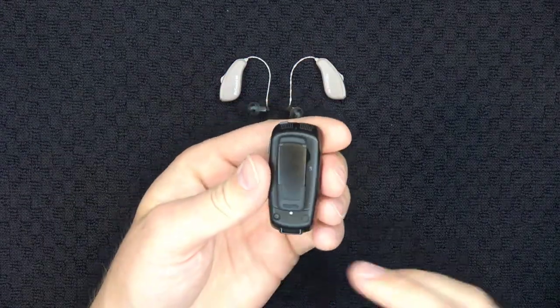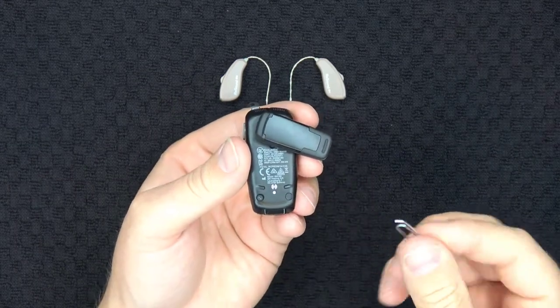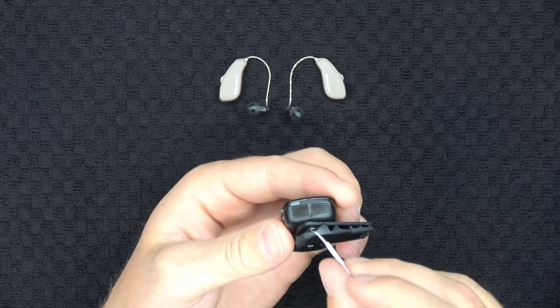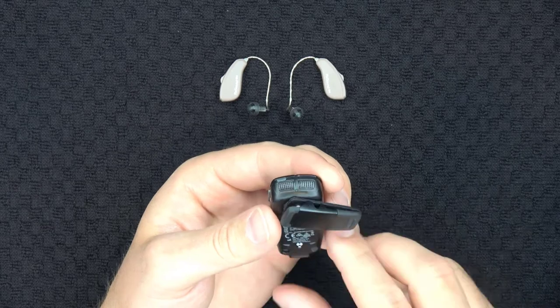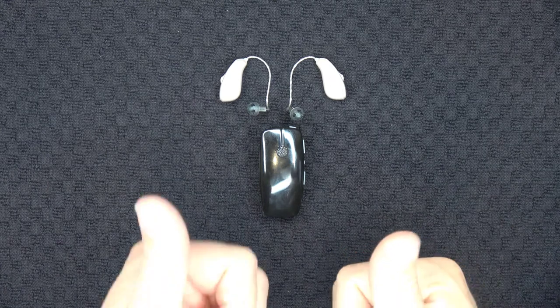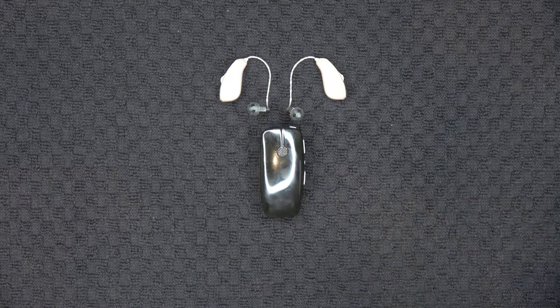Next, locate the pairing button on the back of the Micromic below the clip. Using a small object like a pen or a paper clip, press the pairing button to put the Micromic into pairing mode. You should then see the status light start blinking orange, signifying that the Micromic is in pairing mode. The Micromic will eventually switch from a blinking orange light to a solid orange light when it establishes a successful connection to your devices, and you will also hear a melody played in your hearing aids when this is completed. Once you've successfully paired the Micromic to your hearing aids, you can start using its remote microphone capabilities.